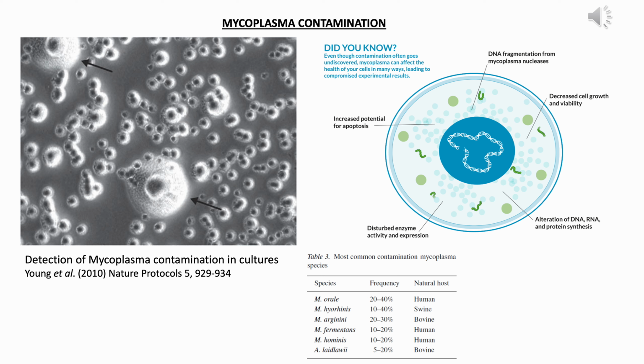None of the aseptic methods that we have discussed are suitable for the detection of contamination by mycoplasma. Okay, so these mycoplasma contaminations are very difficult to detect. They do not change the pH of the media, they do not cause turbidity, the media remains yellow and red in color. And they do not form colonies also. So even if you look microscopically, you may not find colonies like a fungal colony that you can typically see.